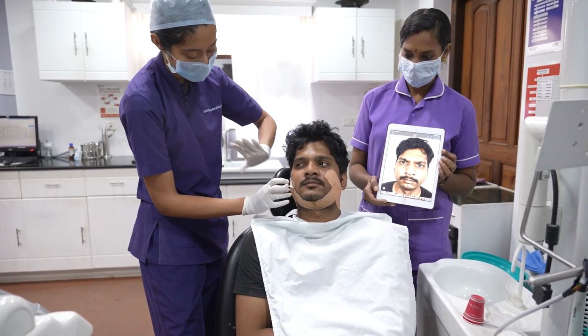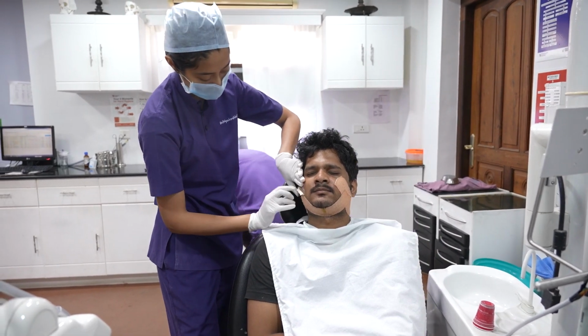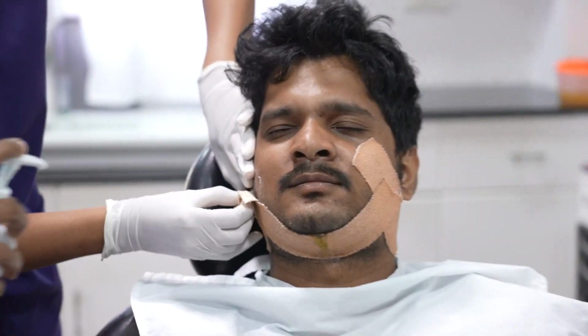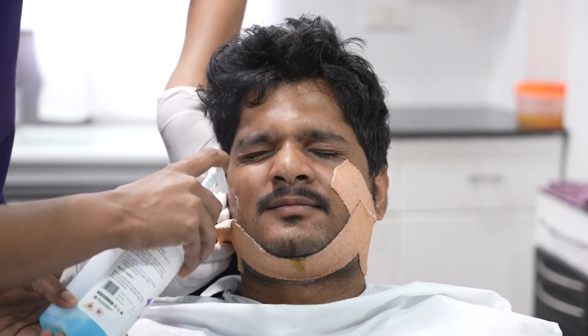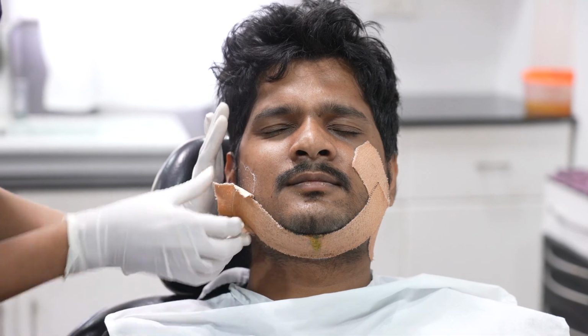Dynaplast removal, the most tricky part. I need a little more sterilium system. Okay, we have soaked it up already. Just bear a little bit with us. Okay, this part won't hurt much. It's removing the lower part.